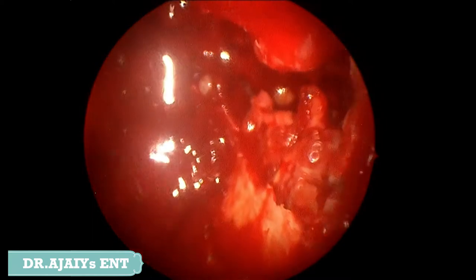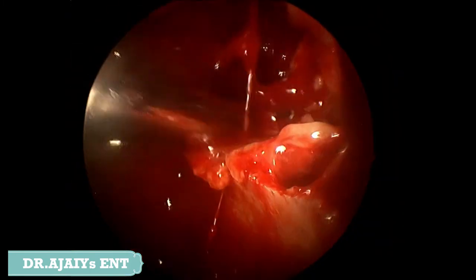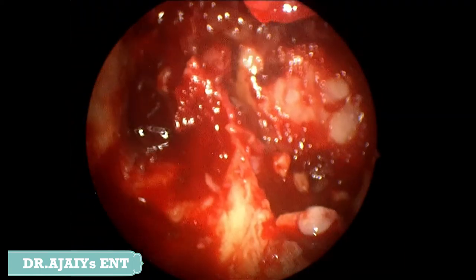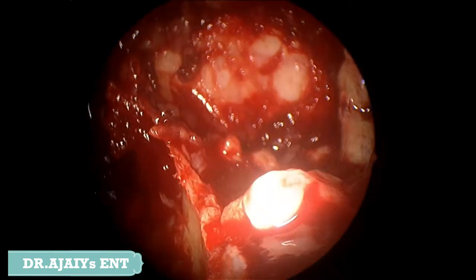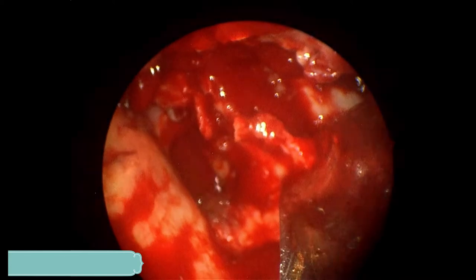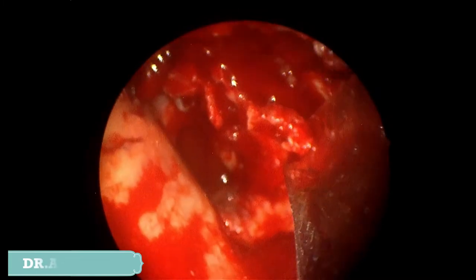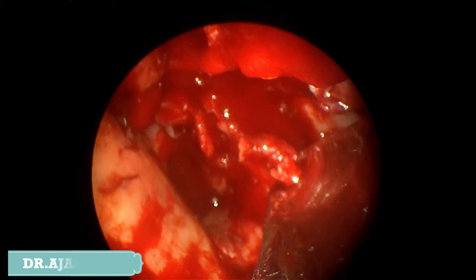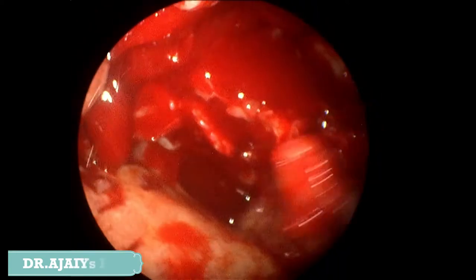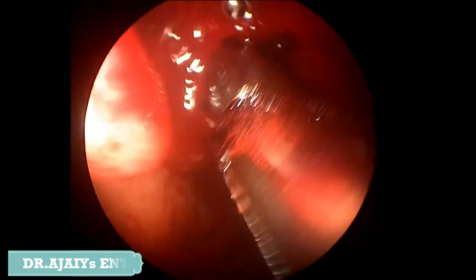We removed the contents from the maxillary area. We could still see fungal necrotic debris along the floor and medial wall of the maxilla. We needed bigger access, so we further removed the medial wall of the maxilla. Since we did not have a burr at the time, we used a chisel and hammer. The medial wall was already necrotic with osteolytic involvement, so it was easily removed. We then proceeded to the ethmoidal area and removed the bulla ethmoidalis.